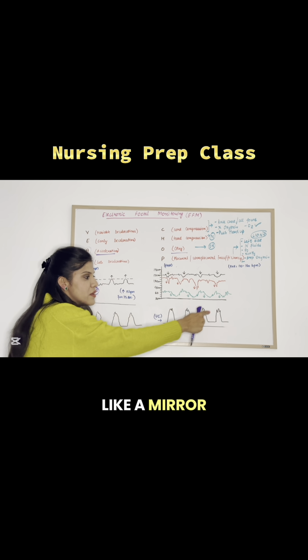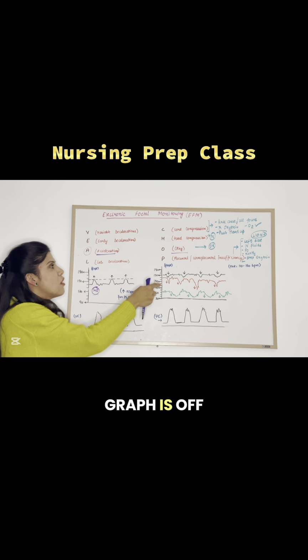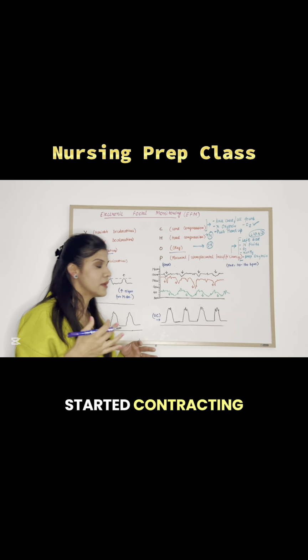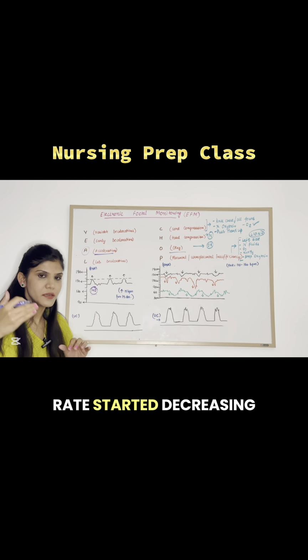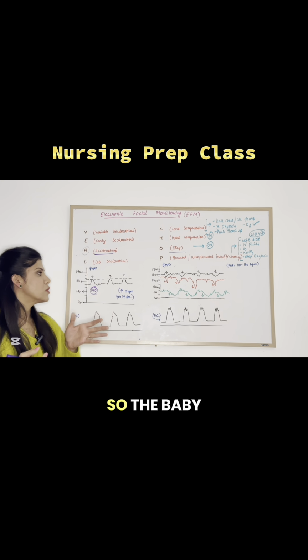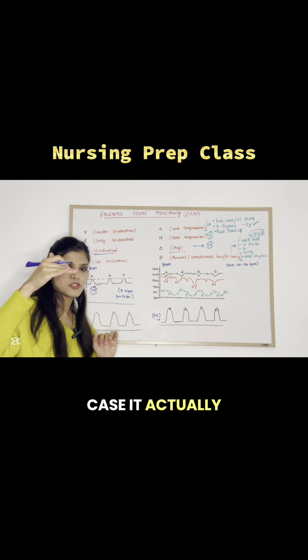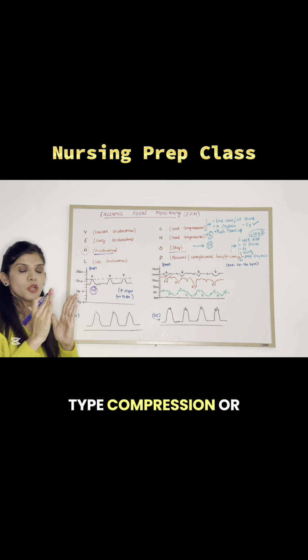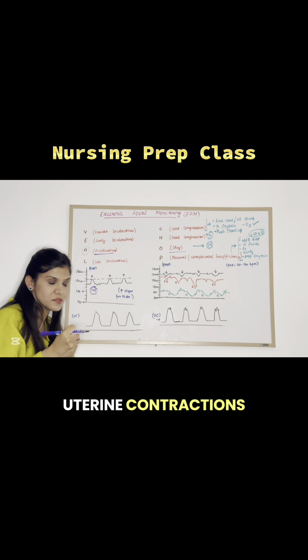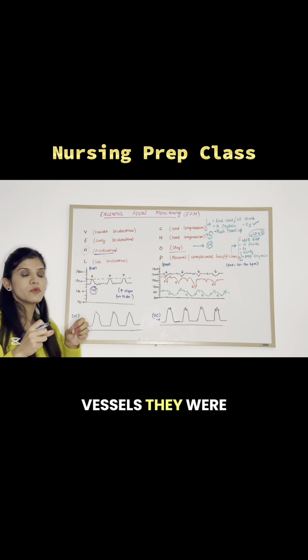If it looks like a mirror image of the uterine contraction below, that means that graph is of early deceleration, because as the uterus started contracting, the baby's heart rate started decreasing. Now, in this case, the baby showed a different response. The baby normally accelerates, his heart rate accelerates, but in this case, it actually dipped because of that head compression, or because of the blood vessels which were being compressed by the uterine contractions. The heart rate was declining because all the blood vessels were squishing.